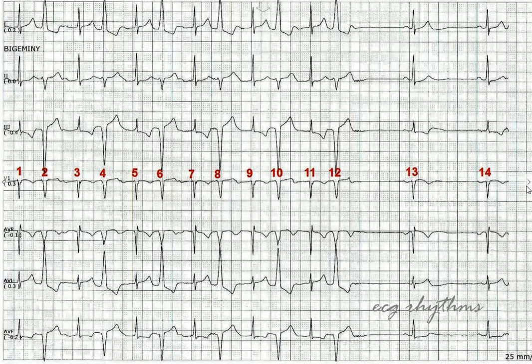QRS complexes 1, 3, 5, 7, 9, and 11 are all conducted with prolonged PR intervals — about 0.28 seconds. The PR intervals of complexes 13 and 14 are shorter, about 0.16 seconds, compared to the ones mentioned before.